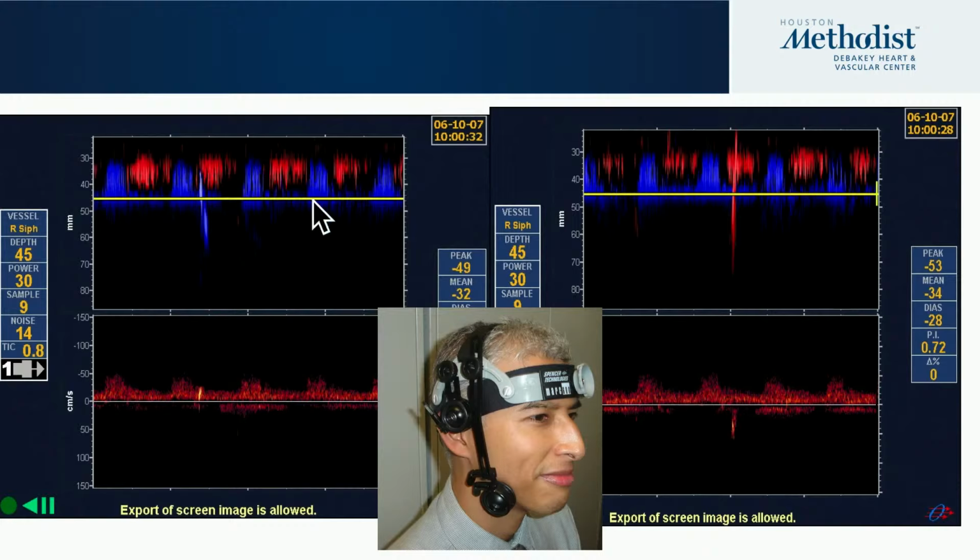So that's almost like you can time a cerebral circulation, if you will, time what time this bubble went up to the brain, if you just inject those simple bubbles, and you see when it started to come out on the IJ. I think this is really fascinating how you can time it, and again, just count them.